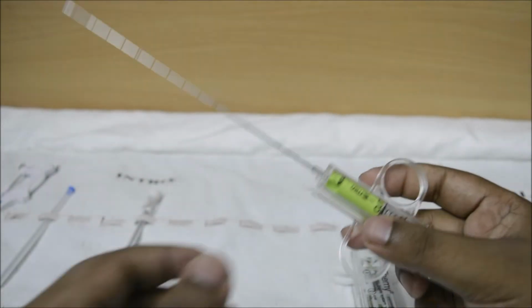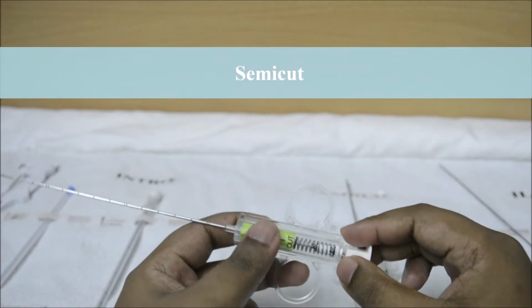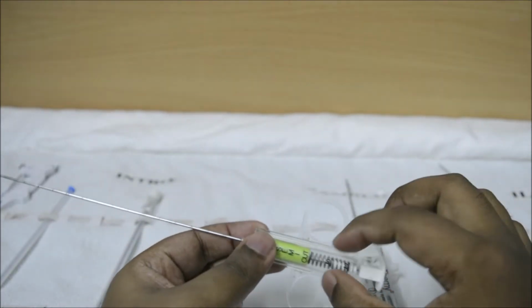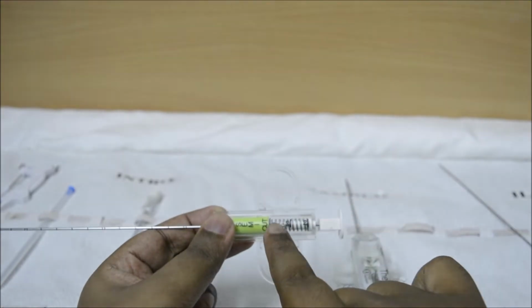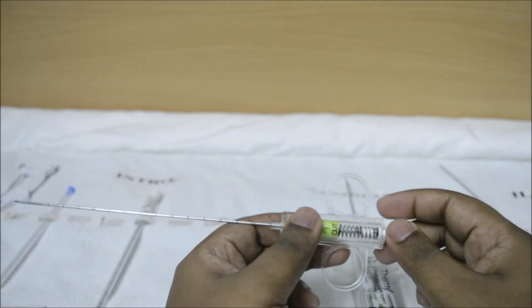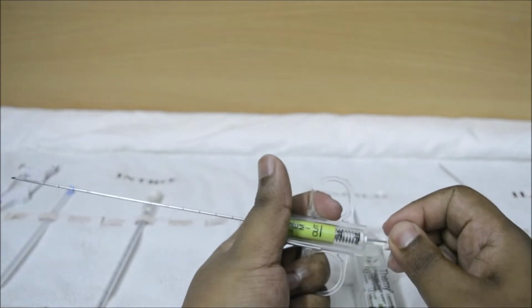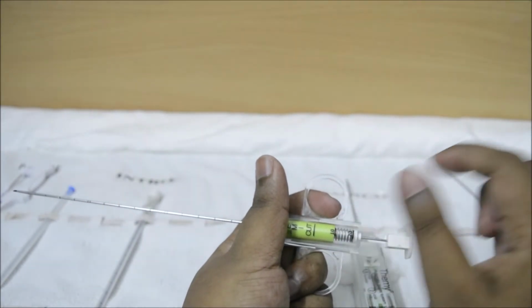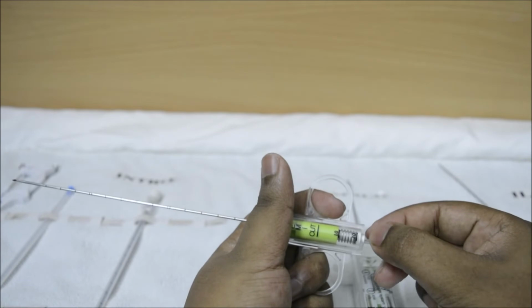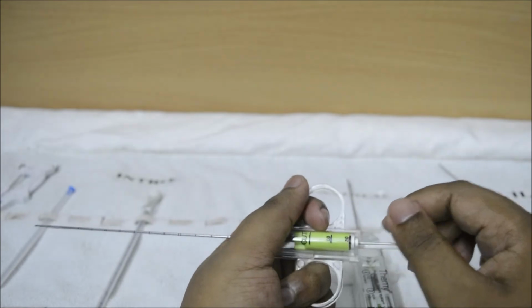So the next type of needle which we have is called the semi-cut, or the semi-automatic soft tissue biopsy needle. Now this needle has a trigger, a cannula with an echogenic marker and distinct volume marks, that is 10 mm and 20 mm. So how is it performed? The doctor first presets how much volume of sample is required. For example, the doctor requires only 10 mm of the sample. So the trigger is pulled and 10 mm is set. You can feel a gentle feel when 10 mm is reached. And if you want to take 20 mm, just pull it further and again it gets locked at 20 mm.